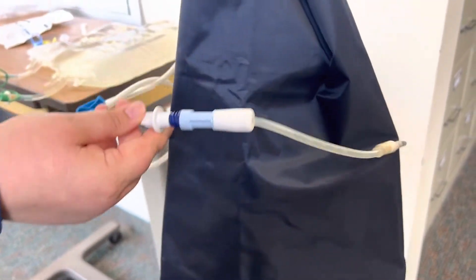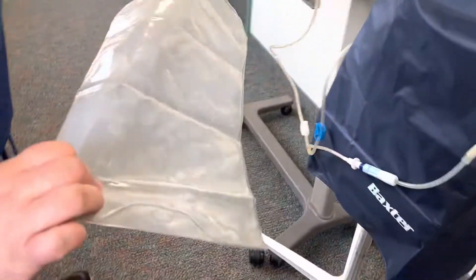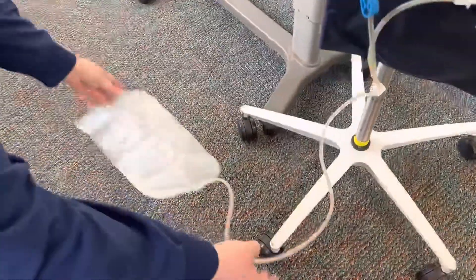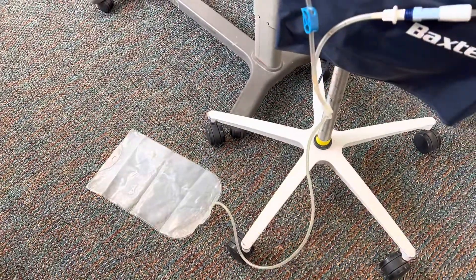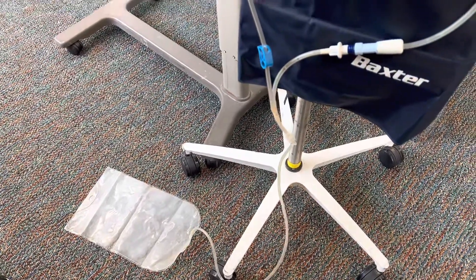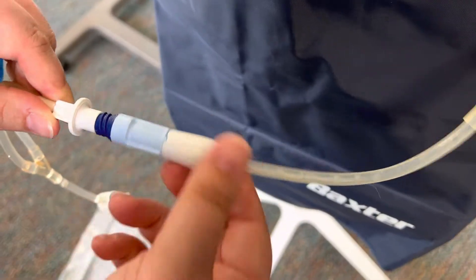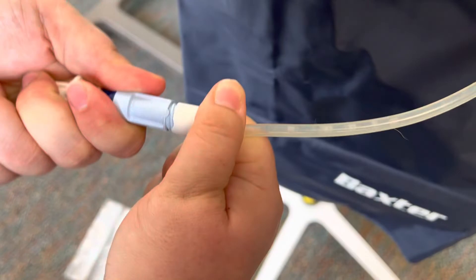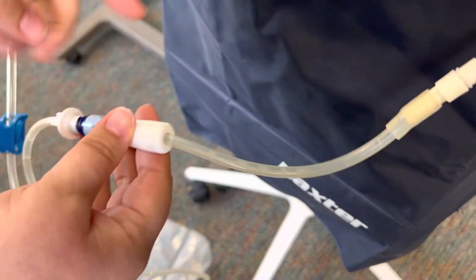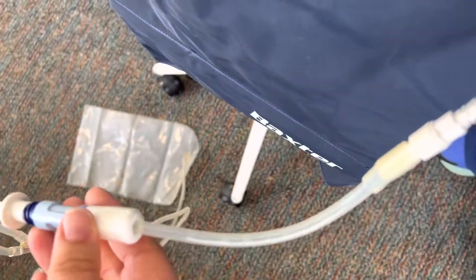As you have everything connected, there should also be this bag with a clear and a cloudy side. Place the bag cloudy side down so that when you drain the peritoneal cavity you can look and see the output. We're now ready to drain the abdomen — turn this so the twisty part is all the way open and you should start to see some trickling down from that peritoneal cavity.